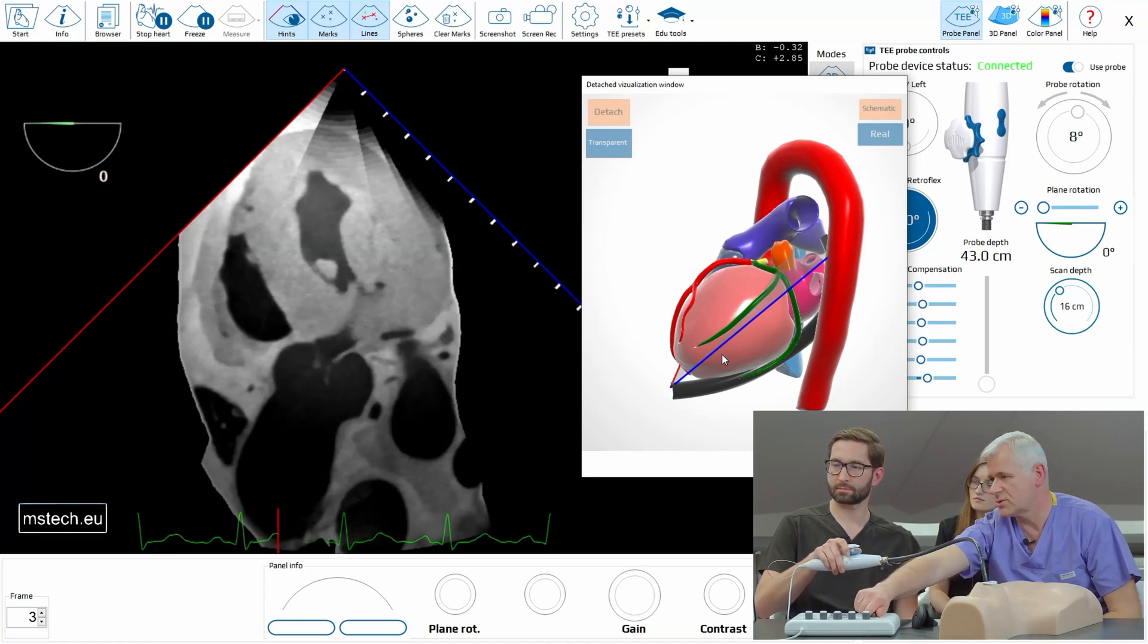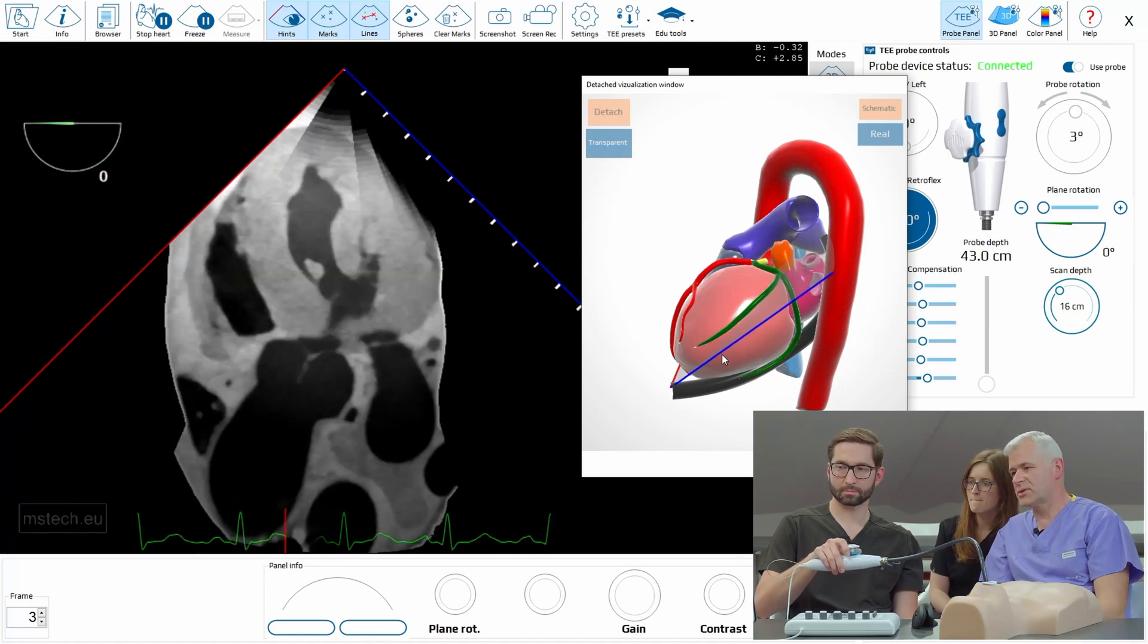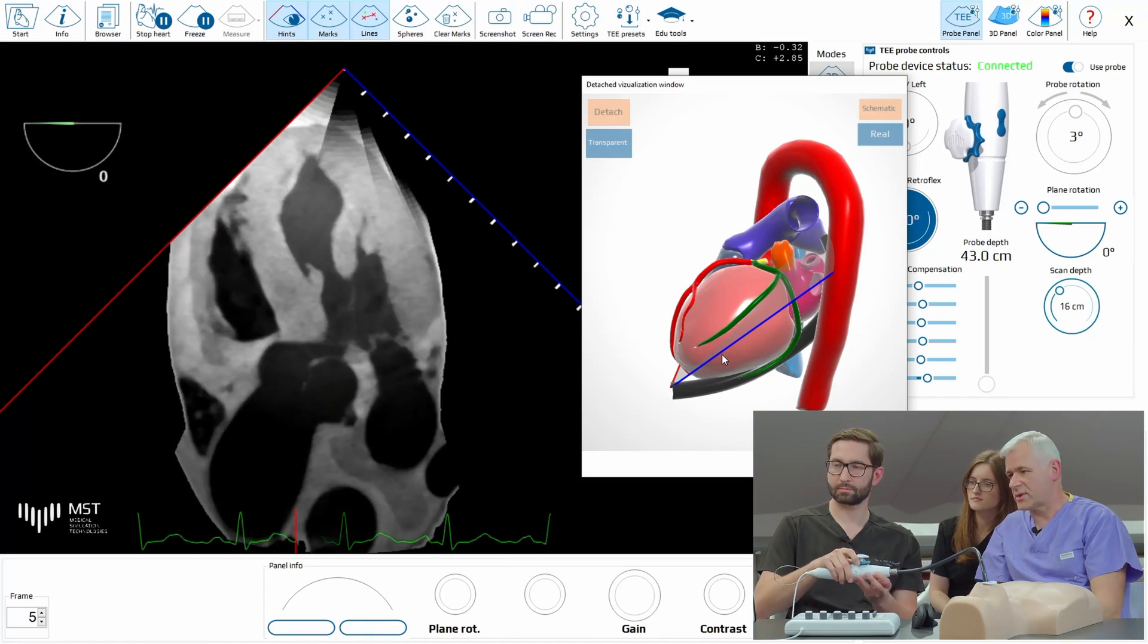Here of course you can also use the Doppler, the spectral Doppler to measure some aortic pathology. But you have to know how to get there.